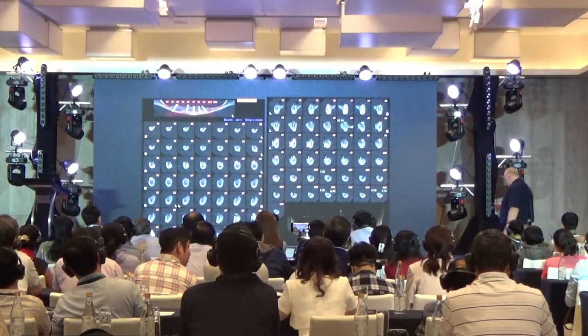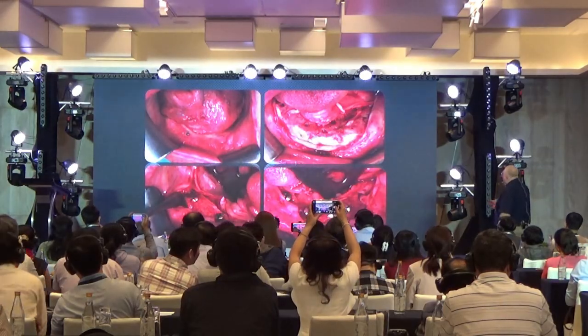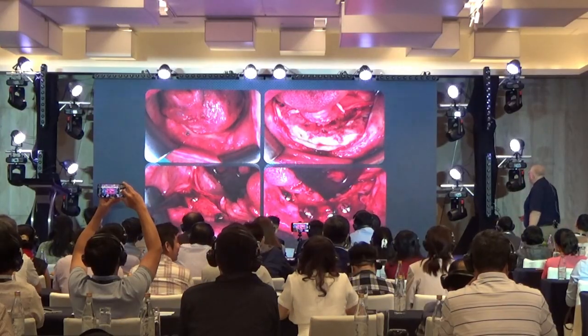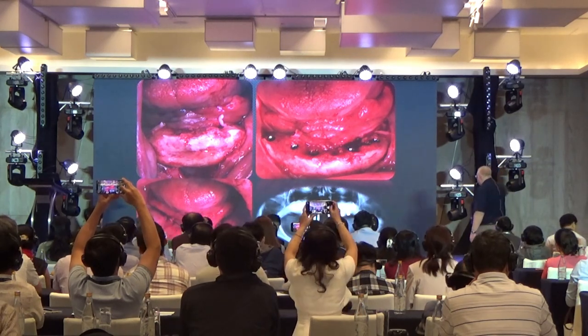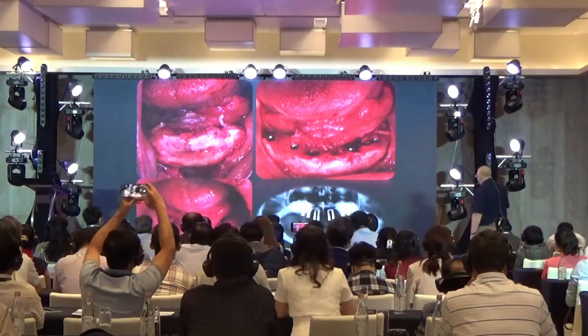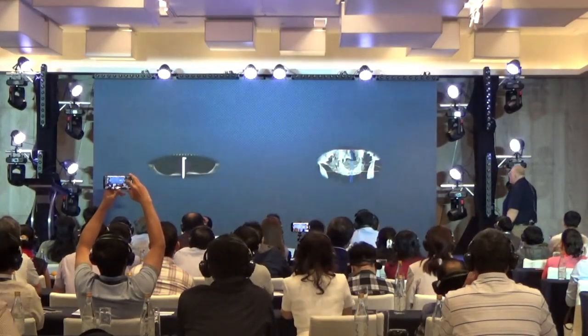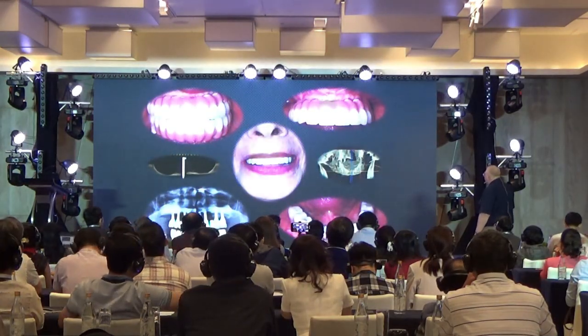And we took everything out. And look at the chin, and look how nicely the new bone was generated. So we placed implants in maxilla and in the mandible. This is how she started and this is how she ended.